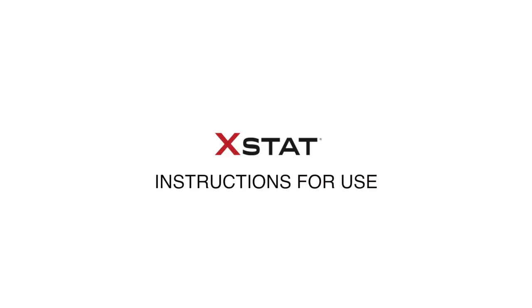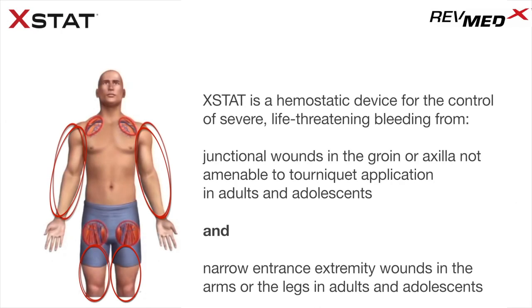Extat is a hemostatic device for the control of severe, life-threatening bleeding from junctional wounds in the groin or axilla not amenable to tourniquet application in adults and adolescents, and narrow entrance extremity wounds in the arms or legs in adults and adolescents.